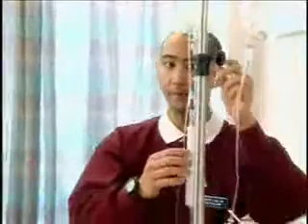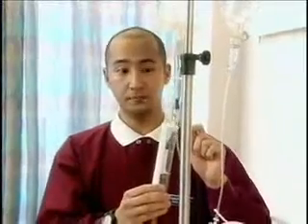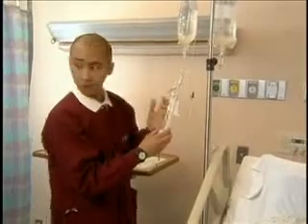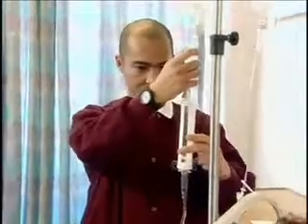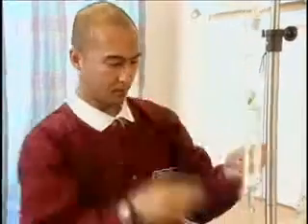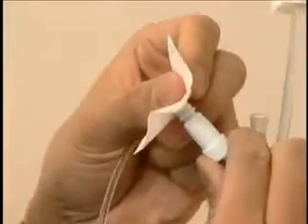Okay, so first, I begin by opening the clamp between the IV solution and the volume control administration set. And then I fill the chamber with the prescribed amount of solution to dilute the medication, in this case 40 cc's. And there it goes. Then now it's okay to close the clamp. Now I take an alcohol swab and I clean the medication injection port of the volume control set.